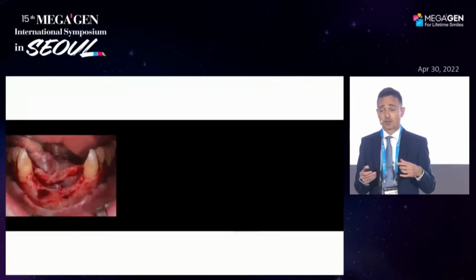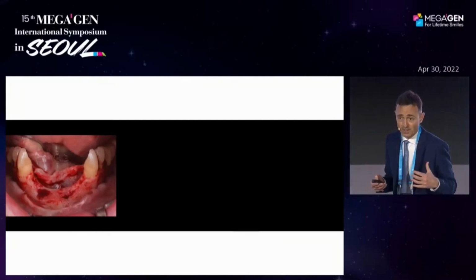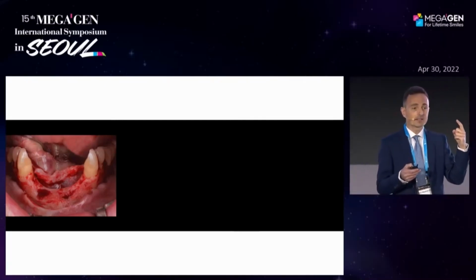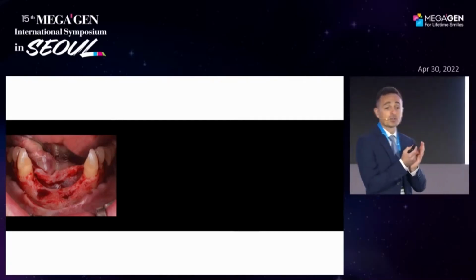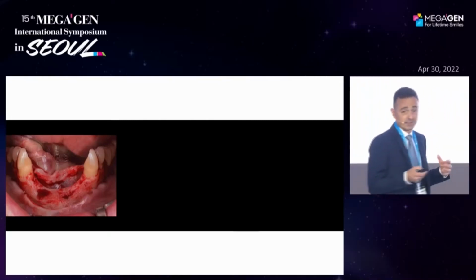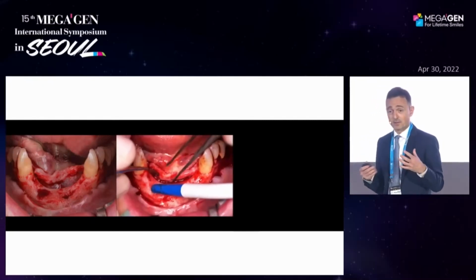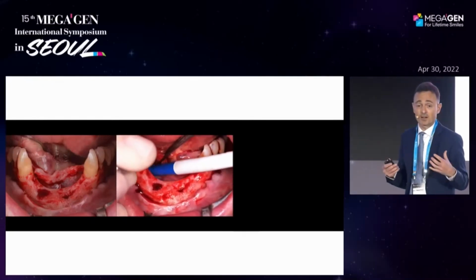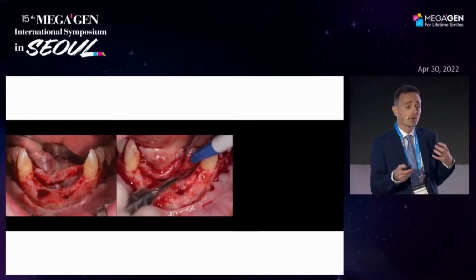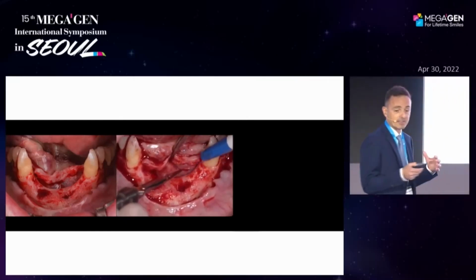So this is the first surgery, and obviously we need to open a full thickness flap, because one of the first rules that we have to respect in this case is to maintain and to keep in contact the graft with the receiving site. Then the first thing I would like to do in the first part of the surgery, when I'm not tired, is to perform the periosteal release that, in my opinion, is one of the most important parts of the surgery, a key to success.